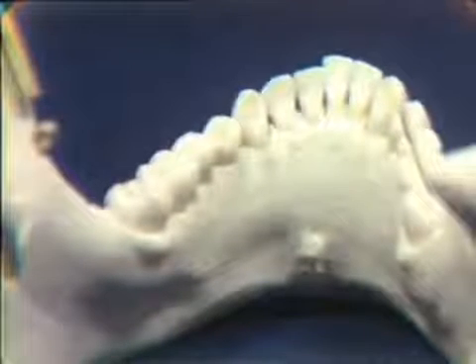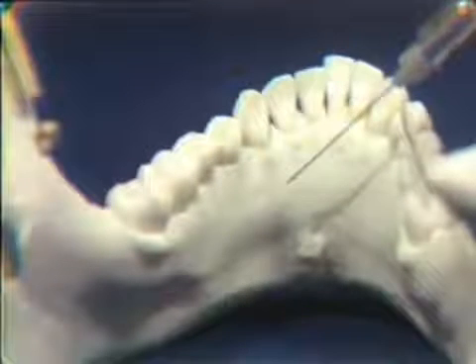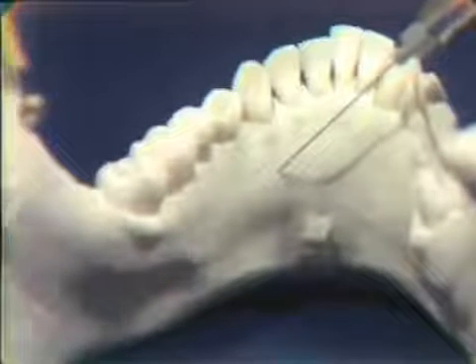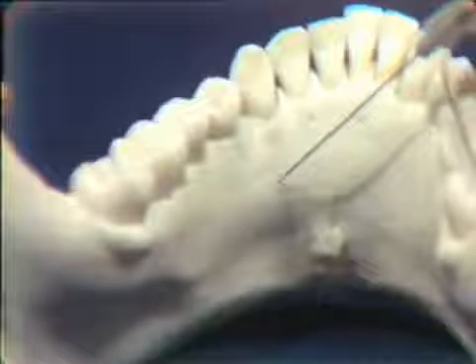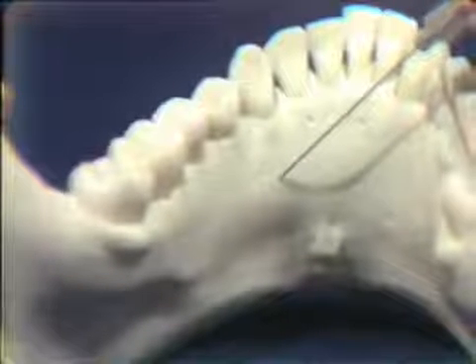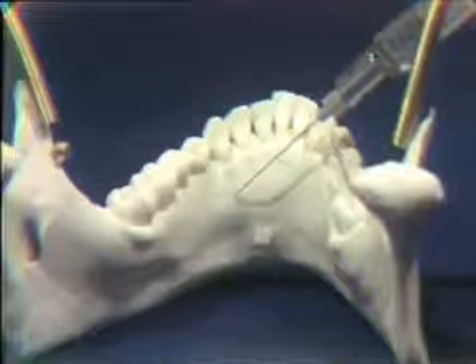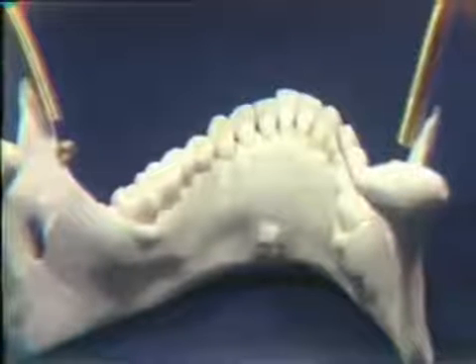With the patient open widely, we can sneak in behind the anterior dentition here, and right where the lingual soft tissues of the floor of the mouth reflect onto the alveolar ridge, we make our puncture and just carry several millimeters deep, and again deposit approximately a half a cc of anesthetic solution, and this will accomplish our purpose.